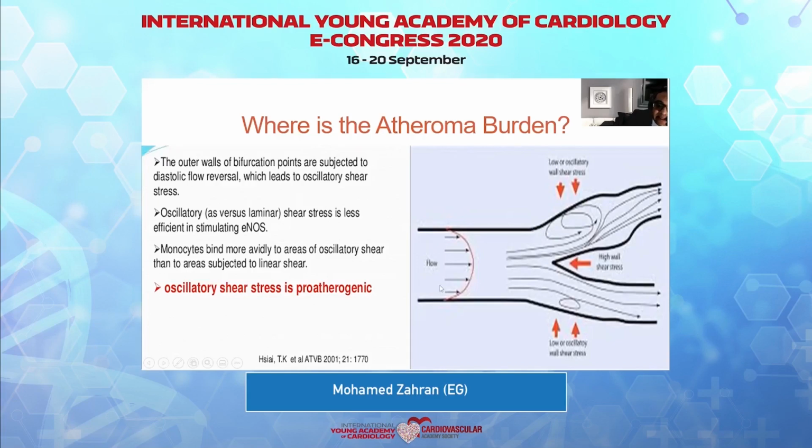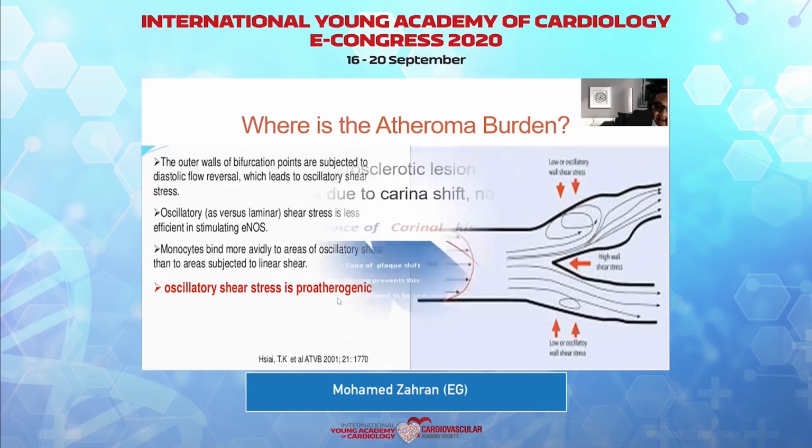So if you put a stent extending from this main branch towards this side branch, for instance, and this flow divider or carina is moved towards here, you will get a pinch in this side branch. And if you get a pinch in this side branch, you should not be so worried, because actually, no problem, because you just need to dilate here and reconstruct or realign this carina to its normal position again.